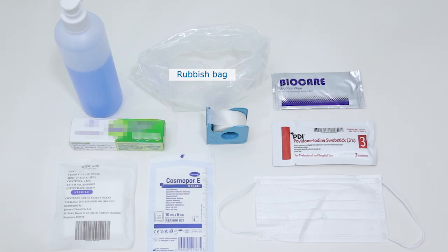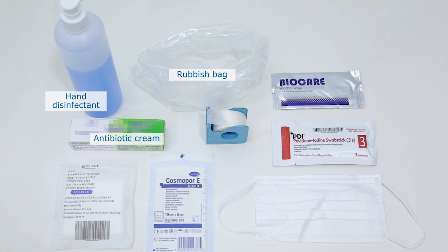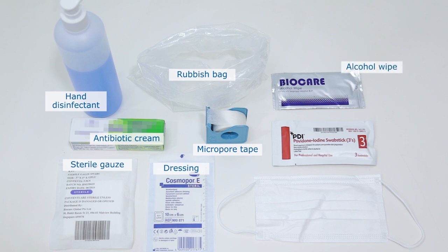Have the following dressing supplies ready for your use: hand disinfectant, antibiotic cream if ordered by doctor, sterile gauze, dressing, micropore tape, alcohol wipe, iodine swab sticks, and face mask.